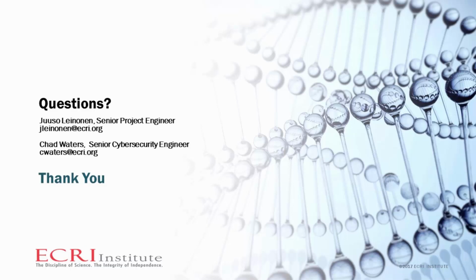And this is Chad. I would like to add to that, while you're in the procurement process, definitely ask for technical documentation like the MDS2 form that would have information regarding network capabilities, and definitely get your IT department involved in the evaluation as well.